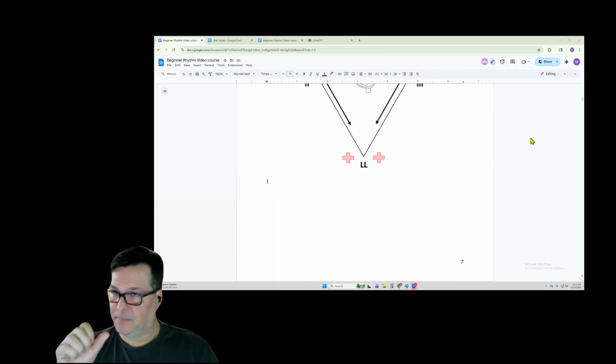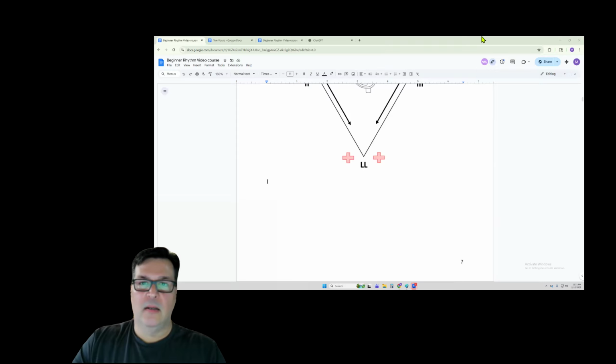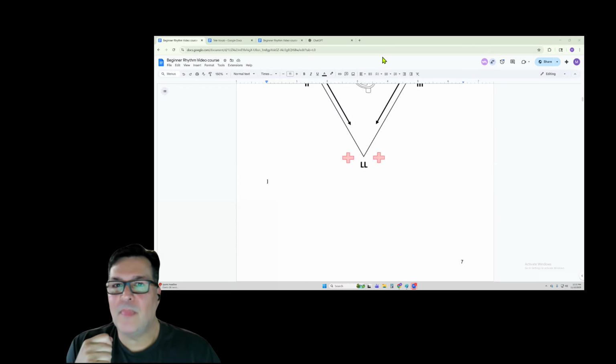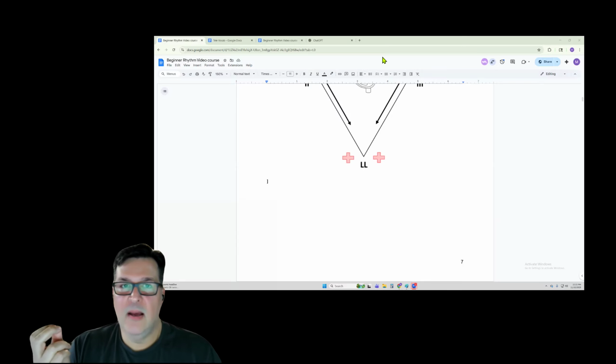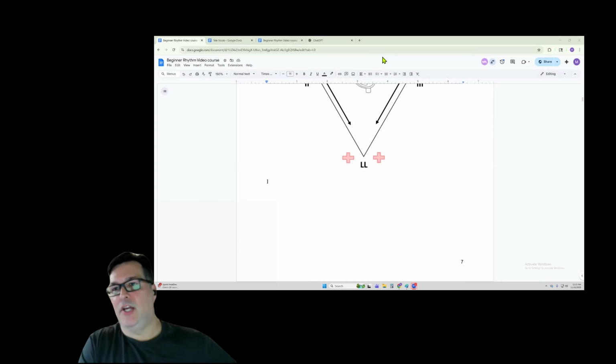So they might look like, excuse me, interjection. They might look like, oh, look at that, Kristen. They might look like they're sticking to the skin well, the stickers, but because the jelly's dried up, they're not giving a good image. So they need to be changed daily.